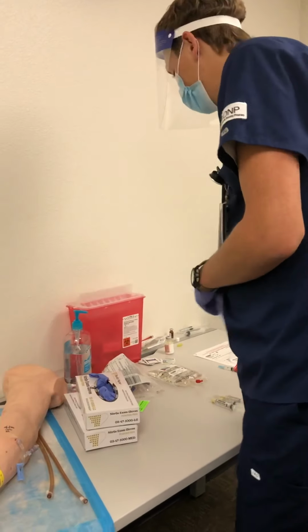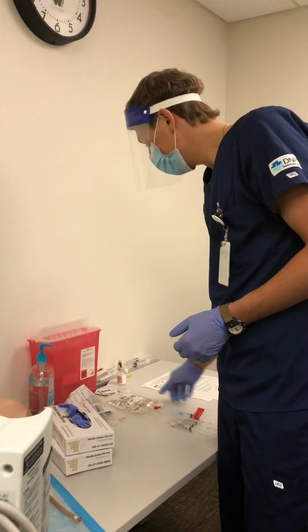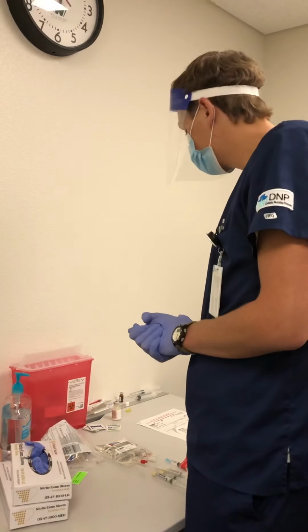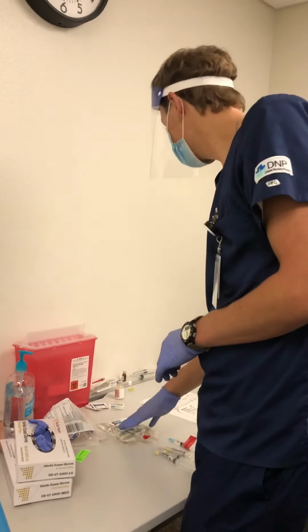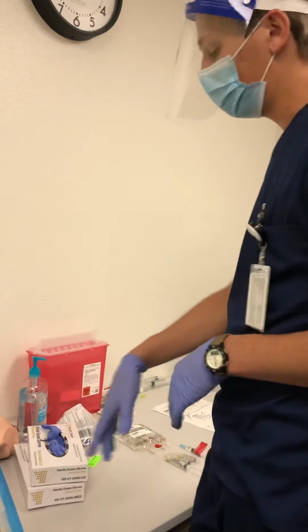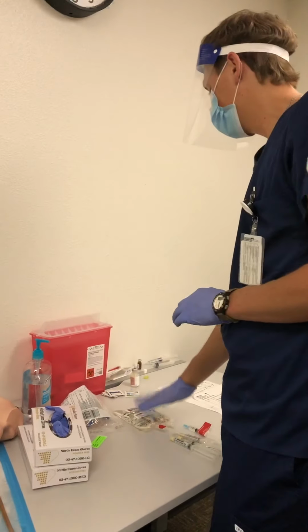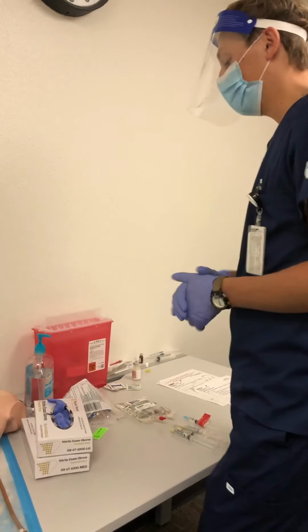So I can then go ahead and explain to them what medications I'll be giving them. So, hi Shirley, I'm just going to be giving you some morphine for that pain that you had. You said it was an 8 out of 10, so I was just going to give you that. It's time for you to be able to get that medication. And then I also have here some potassium chloride that will hang on the IV and it'll just go in through your arm. When we drew your blood this morning, it was at a 3, and that's a little on the low end, so once we finish this, you should be right back where you need to be. Any questions? No? Okay, good.